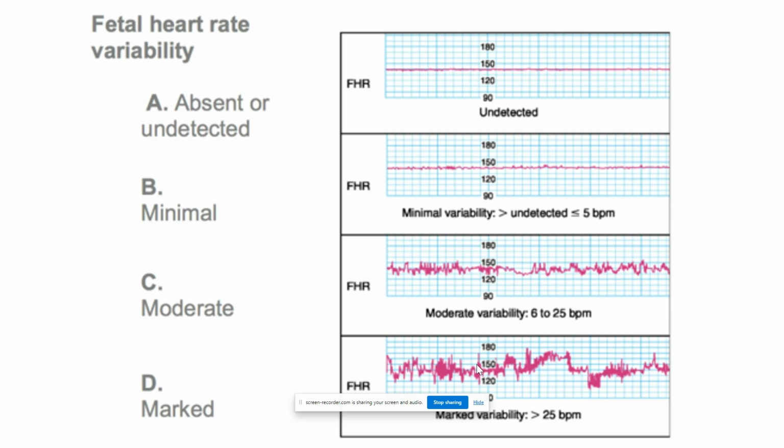These systems exert their control via the cerebral cortex, the medulla oblongata, the sympathetic ganglia, and the vagus nervous system. So the interaction between these systems results in the difference in the beat to beat intervals, resulting in variability of the fetal heart rate tracing. So in the full term fetus, moderate variability is considered normal because it indicates a normal functioning central nervous system.